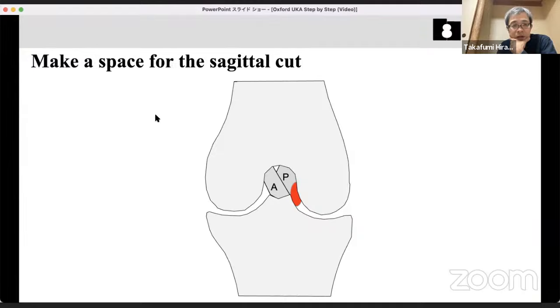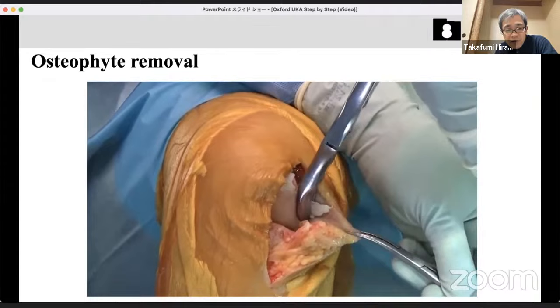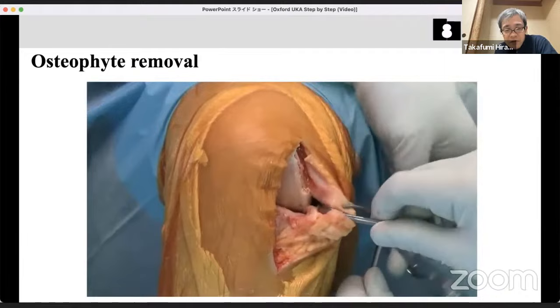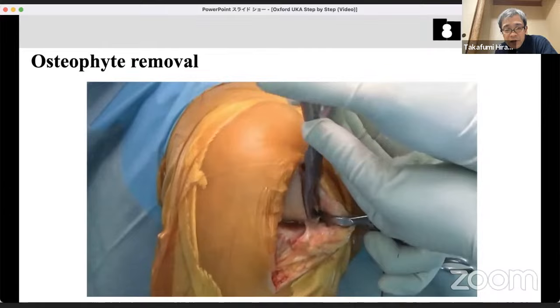Making the space is very important because sometimes the sagittal bone saw can run and damage the PCL, which is closely attached to the medial femoral condyle. Use the elevator to make space and simulate the pathway of the sagittal bone saw. Then remove the osteophyte at the medial edge of the medial condyle. This osteophyte can shorten the medial joint gap, and its removal resolves medial tightness.